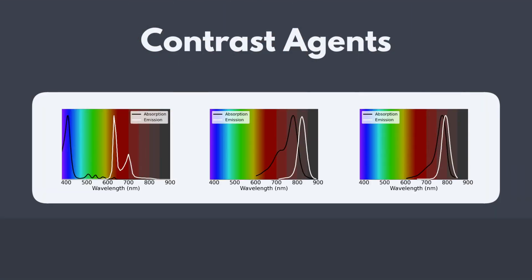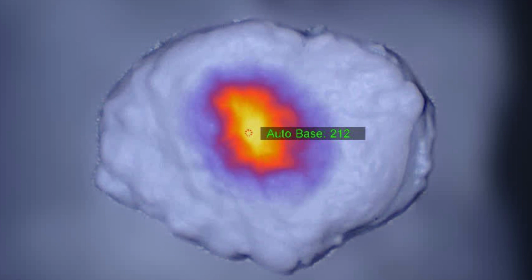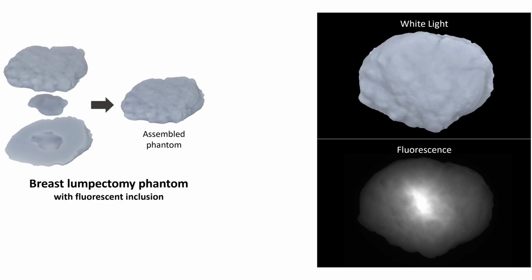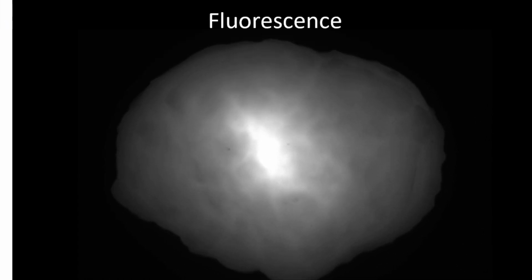Contrast agents convert absorbed light from one wavelength to another. The filtered camera captures the intensity of the fluorescence emissions. The fluorescence intensity is used to provide a real-time intraoperative view of the surgical field where the surgical team can toggle between visualization options. The fluorescence is collected as a black and white or grayscale image, and many system manufacturers display this information using specific color maps. Even when the original fluorescence image is the same, color maps may alter the perceived visualization.